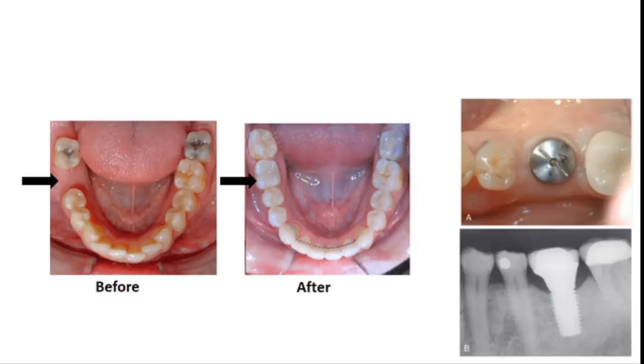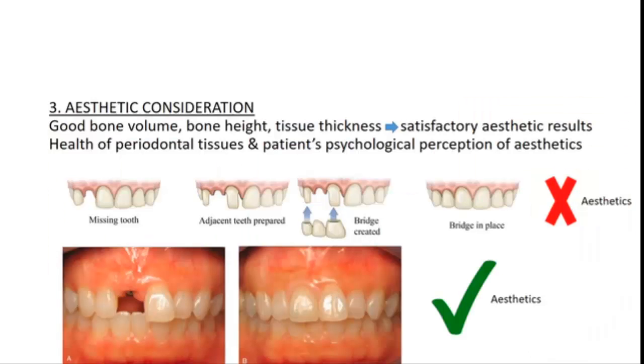Diagrammatic representation, clinically before and after, placement of the cover screw, and the final prosthesis, what you see in the IOPA X-ray. The third is the aesthetic consideration.